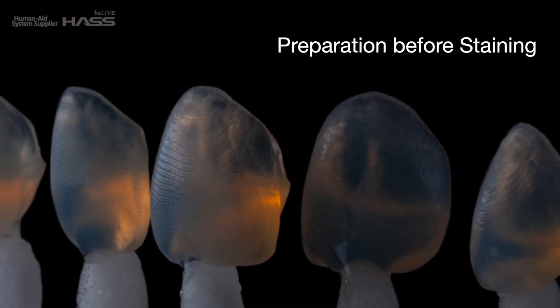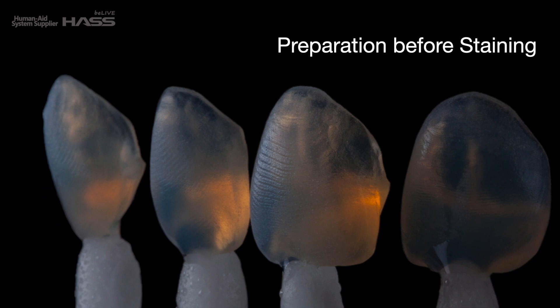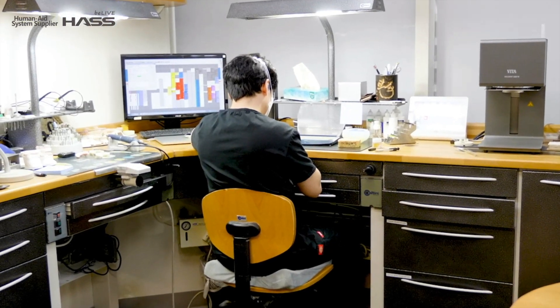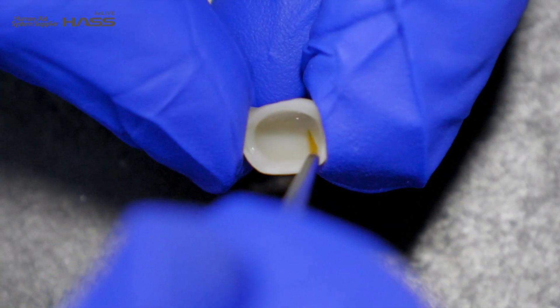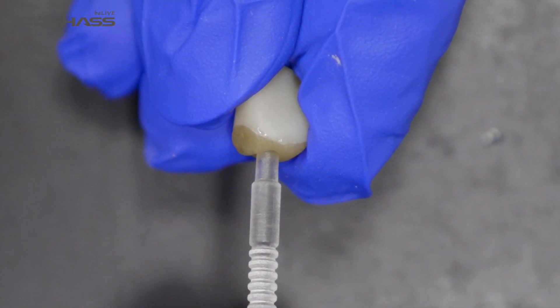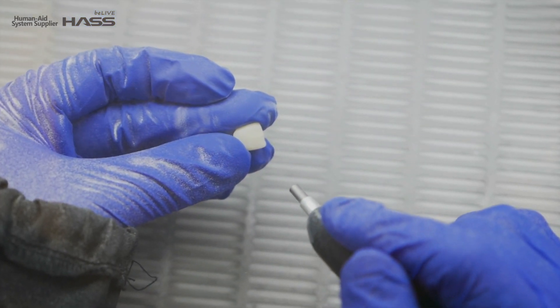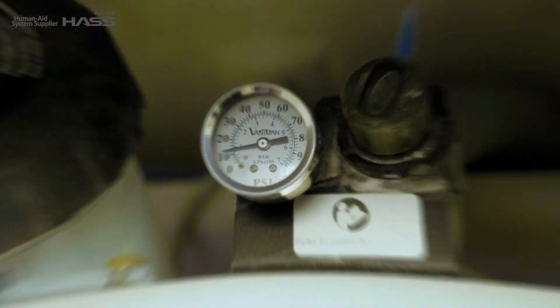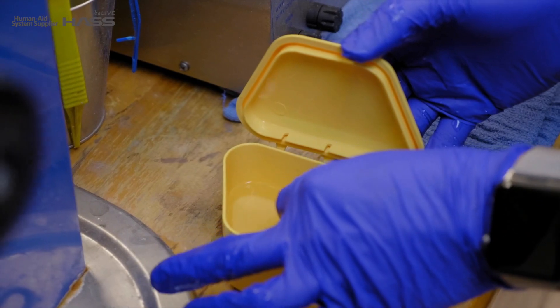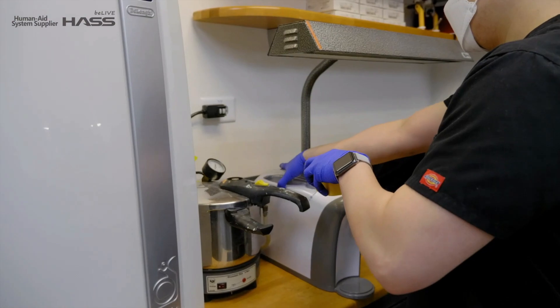Before we start staining, there are a couple of things we need to prepare. First, I strongly recommend making a Stump Shade Dye before staining to achieve the proper shade of the restoration. Second, sandblast the entire restoration with aluminum oxide at about 10 psi or less. And lastly, soak the restoration with alcohol, use ultrasonic for about a minute, and rinse with running water.